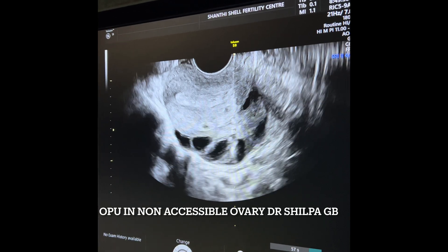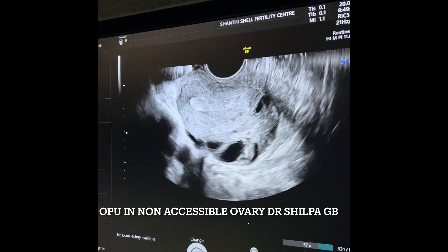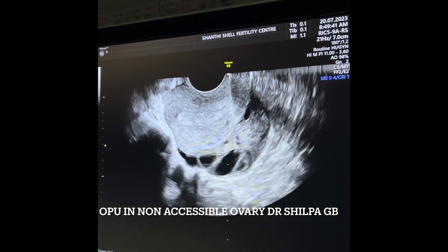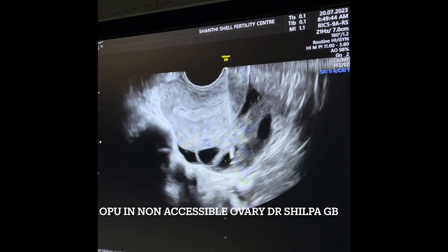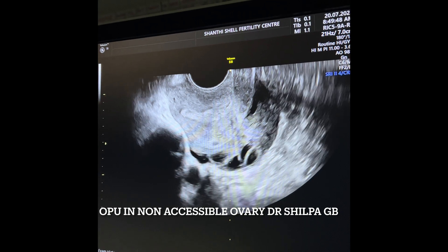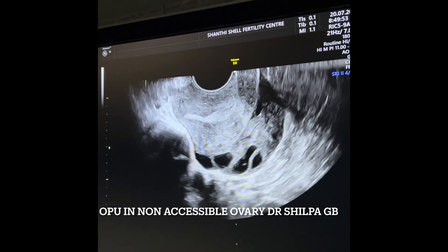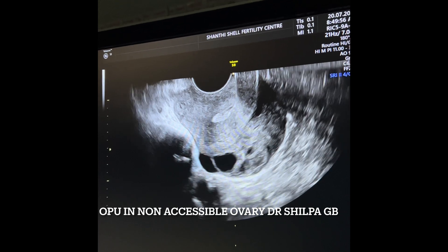The important thing is when you go through and through the uterus and aspirate the follicles, we should not make too many lateral movements, which can cause a tear on the ovarian surface. Once the follicles which are in line are aspirated, we have to check whether there are more follicles beside the ones already aspirated — whether they can be aspirated with the same prick, or you can take out the needle and make a fresh prick.